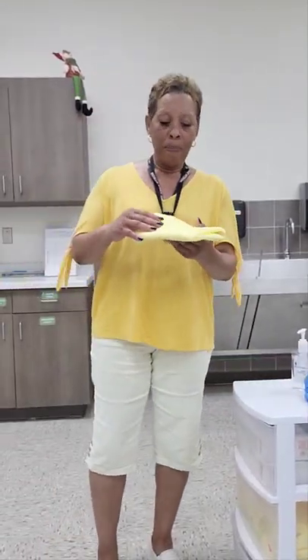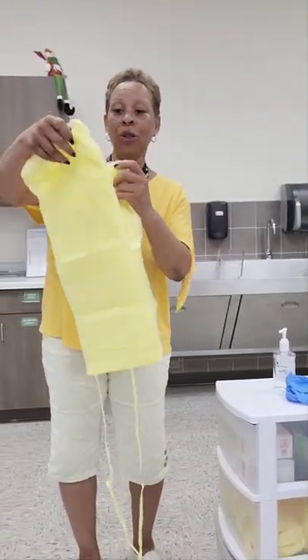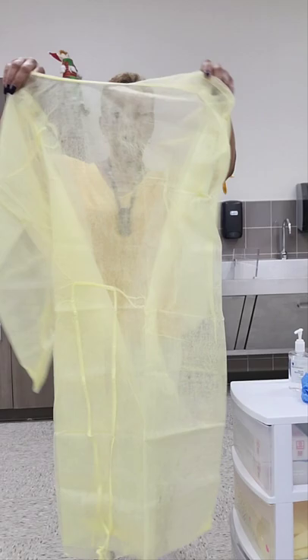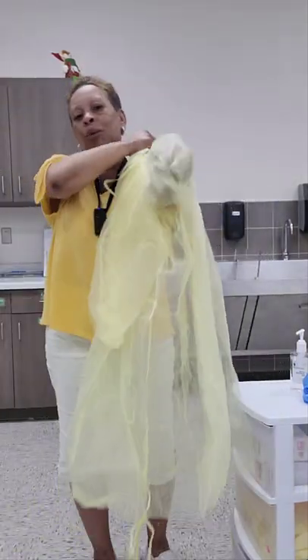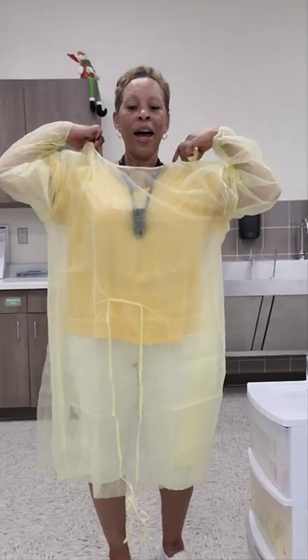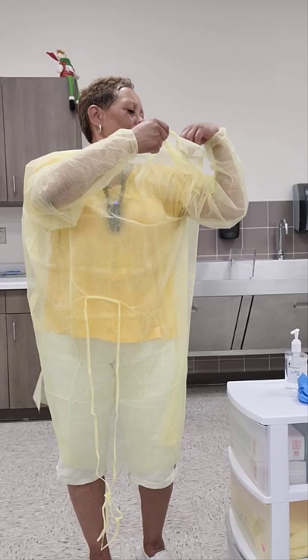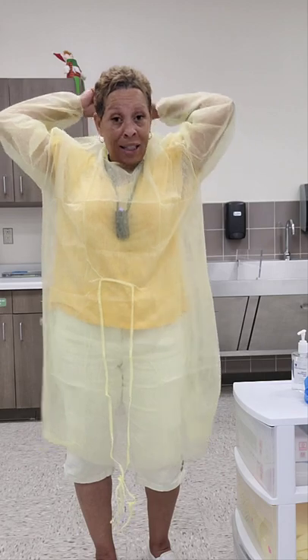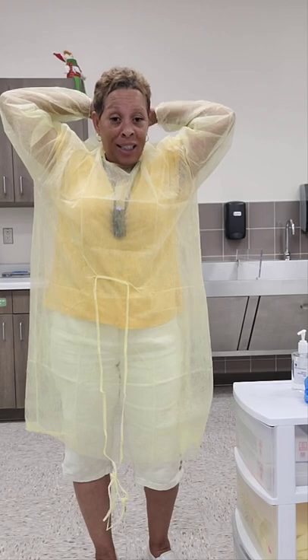I'm going to don my gown first. You'll want to unfold it, ensuring that you do not shake open the gown and that no parts of the gown touch the floor. When you open it up, make sure the back of the gown is facing you, then place your arms into the sleeves. After placing your arms into the sleeves, you'll tie your neck strap. You'll want to tie it in a loose bow or a slipknot so it won't be difficult when untying the straps.